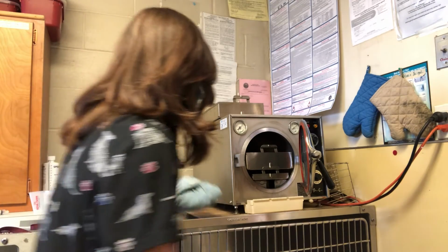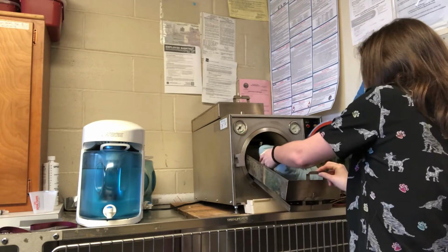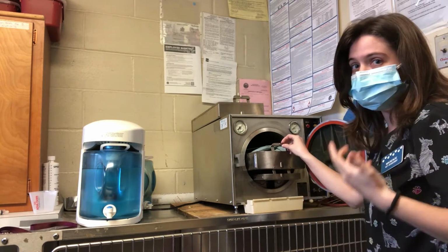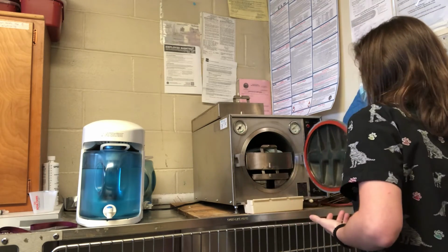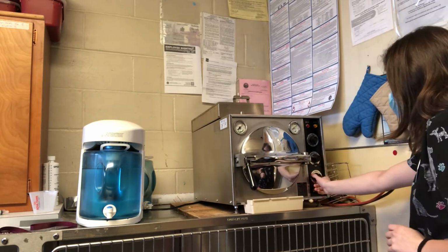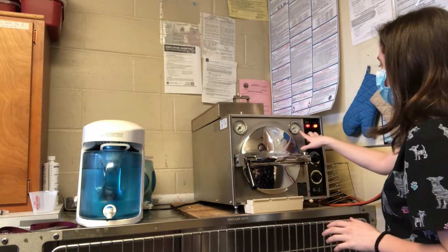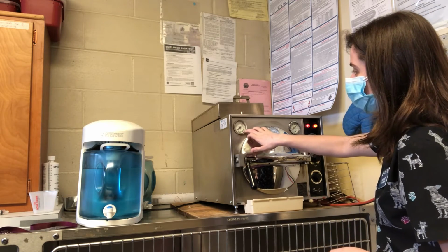So we're going to take our pack and put it in this trough here, and you want to make sure that obviously it's not reaching any of the inner parts of the chamber, because otherwise that will prevent the steam from sterilizing it properly. We'll go ahead and close that. And then I want to switch our machine to sterilize, and we want to put it to about 45 right now, because we want the gauges for the temperature and the PSI to reach these green ranges here.